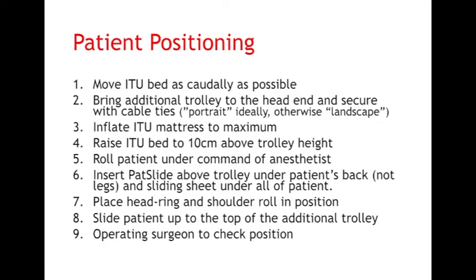We have used a sturdy hand table trolley that we then place at the head end of the bed and attach with cable ties, as well as placing the brakes. The pressure relieving ITU mattress should be inflated to maximum and held at that pressure for the duration of the procedure. The bed should be approximately 10 centimeters above the height of the trolley.